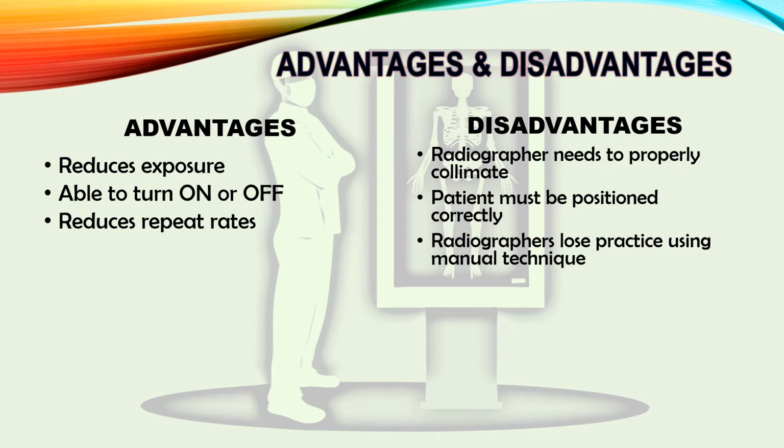Some advantages of using AEC is that it reduces the exposure. You're able to turn it on and off, and it reduces the repeat times of having to take an image.